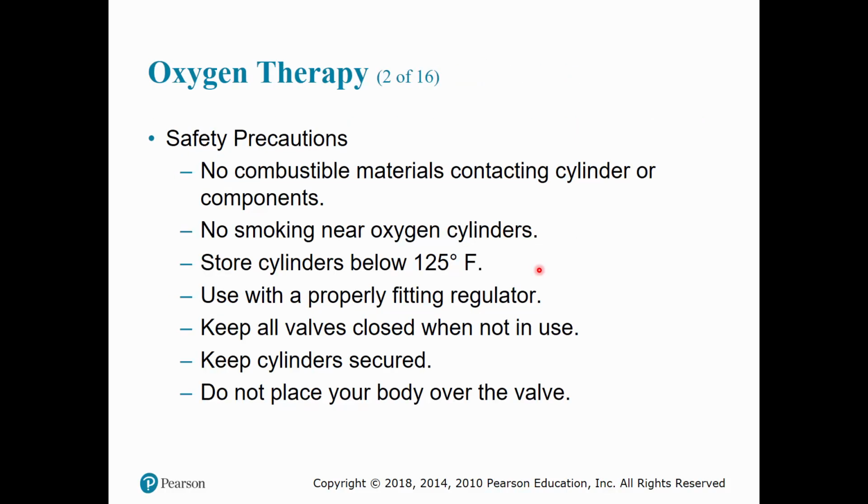There are some safety precautions that you want to take when using oxygen, such as never allowing any combustible materials such as oil or grease to touch the cylinder, regulator, any fittings, valves, or hoses. If oil and oxygen under pressure come into contact, they could potentially explode. Also, never smoke or allow patients or any others to smoke in any area where oxygen cylinders are in use or on standby, because if a fire does break out or if oxygen gets in contact with any open flame, it can make the fire burn more rapidly.